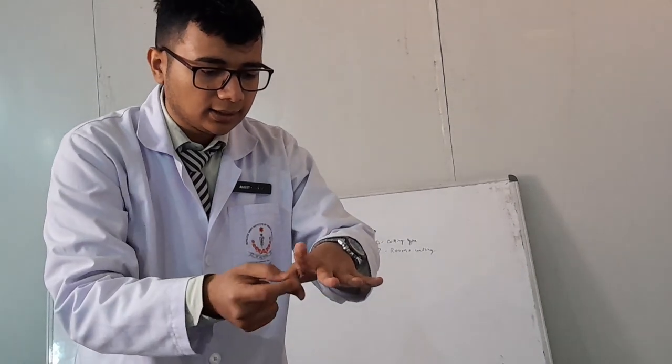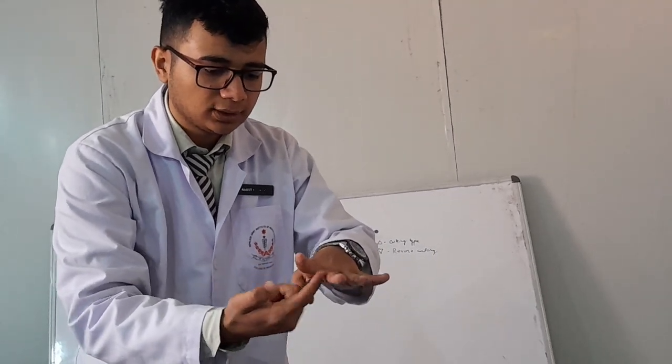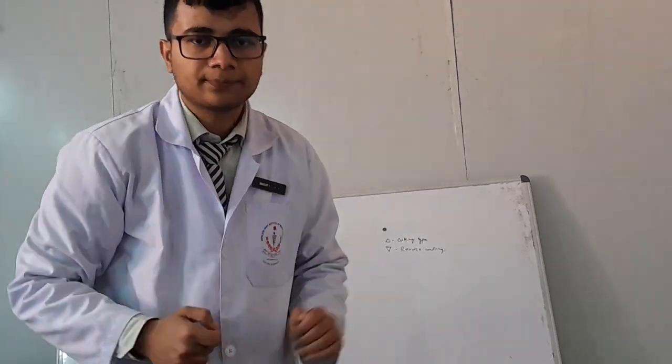So that reverse cutting type of suture needle has been made so that there will be some space, but it will cut through the juxtaposition, that is, the opposite side. So reverse cutting, it will cut from this plane. So it will go this way while putting the needle. So I hope it is clear, okay?